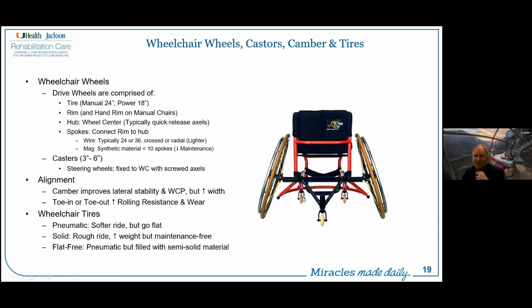Casters have to do typically with the front wheels, and they range in size from 3 inches to 6 inches. Typically, the 3-inch caster is great if all you've got is smooth sailing. So this is nice if you've got nice smooth sidewalks and tile floors, and that's all you ever encounter, that's okay.